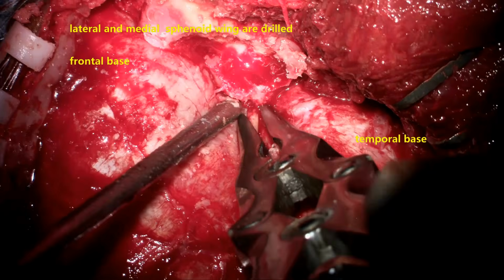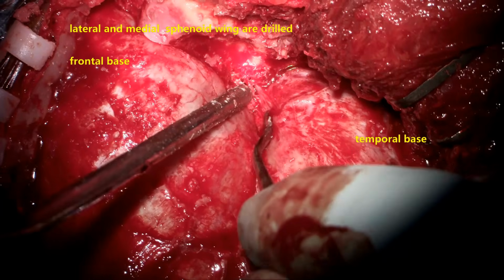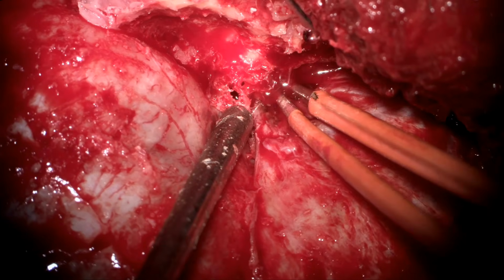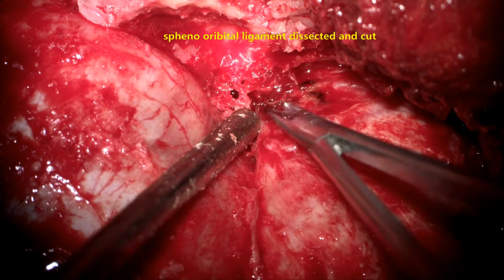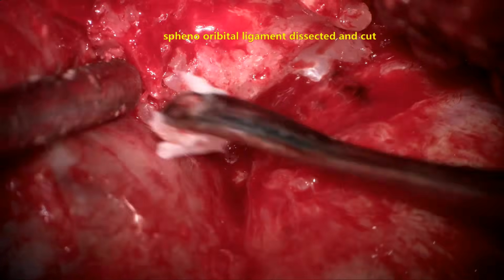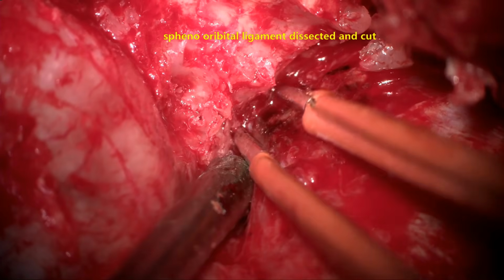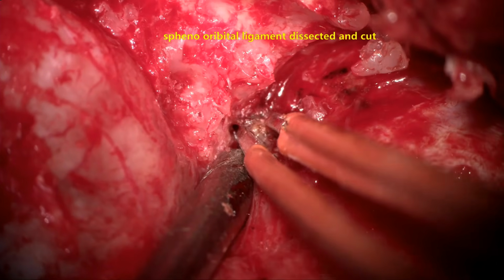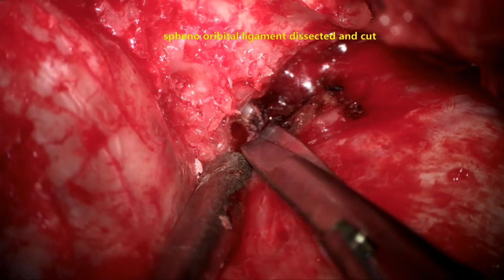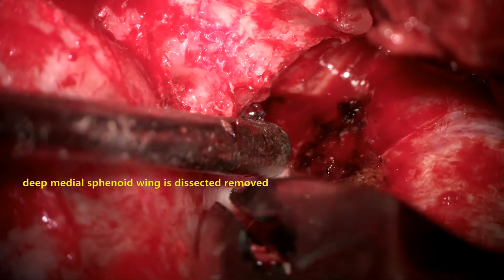As shown here, the bony projections are nibbled with a micro nibbler and the lateral wall of the sphenoid wing is removed. Go gently medially, and you will get the sphenoorbital ligament, which needs to be cut, and that helps in release of the anterior temporal basal dura mater so that we can gently peel the middle cranial fossa dura from the temporal base.